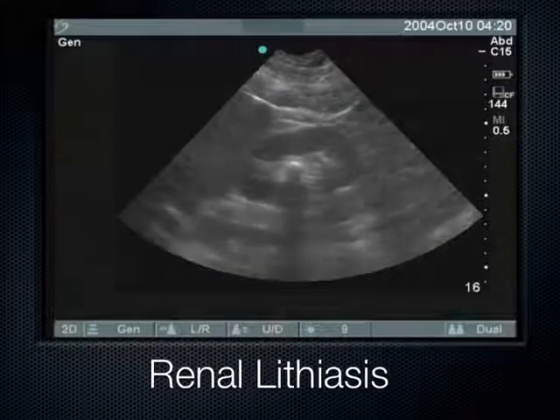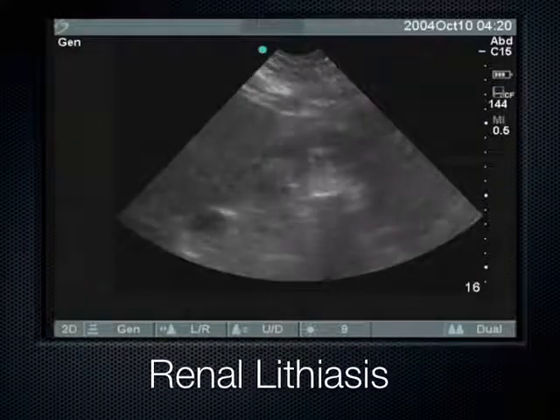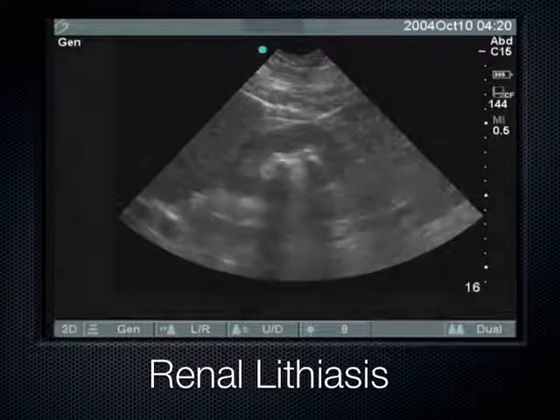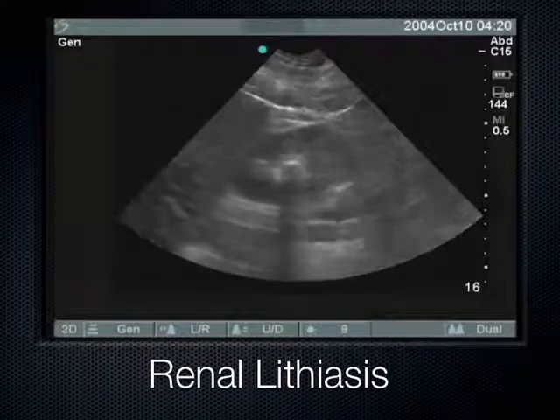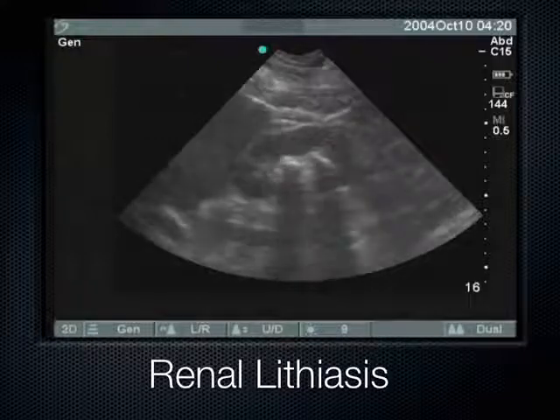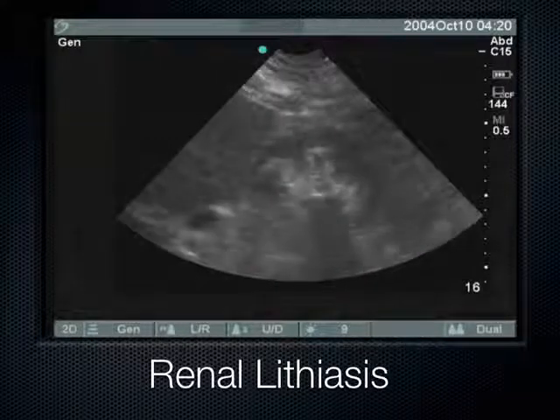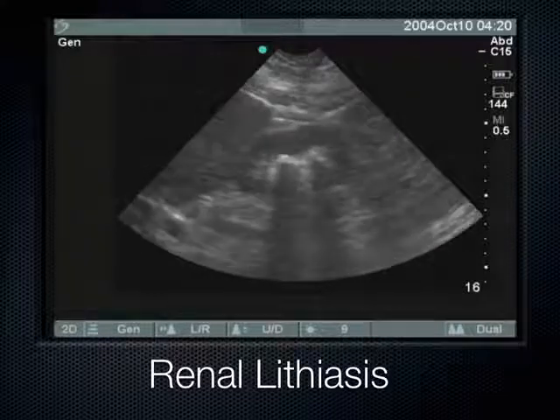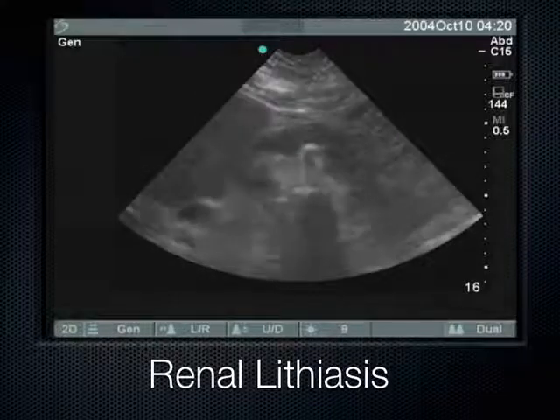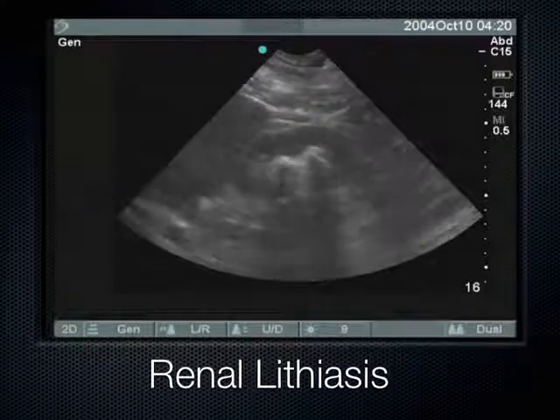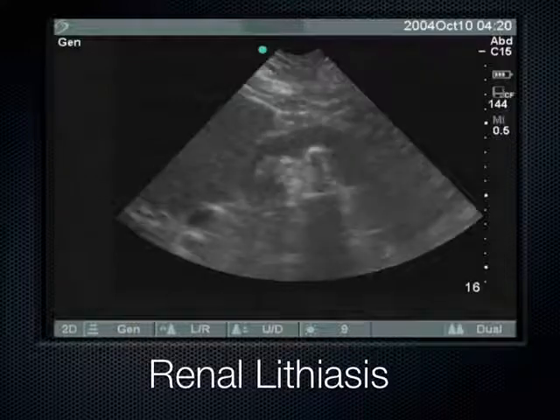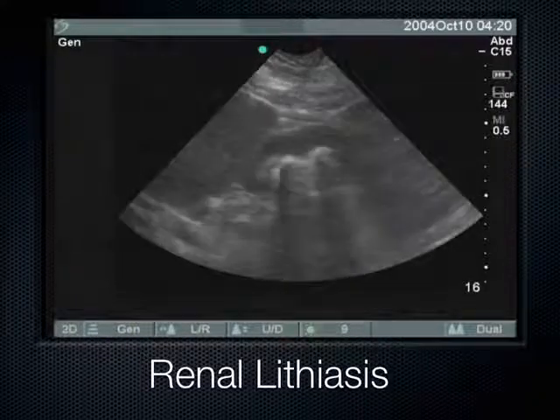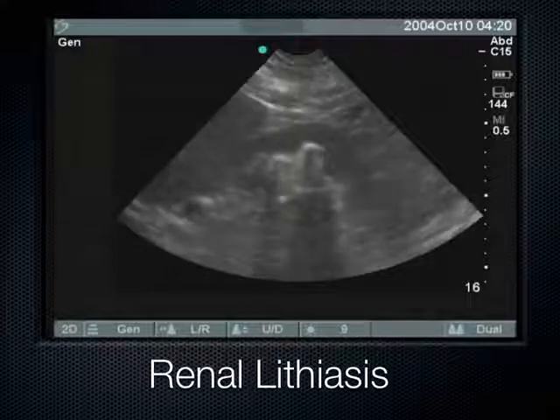When we have a stone — or in this case a couple of stones — we know they're stones because they cast a shadow all the way to the bottom of the screen. Sometimes you'll see hyperechoic stuff that doesn't shadow, but when you get a shadow going all the way to the bottom, you can confirm it's from a dense calcified structure. In this case it's renal lithiasis — kidney stones.